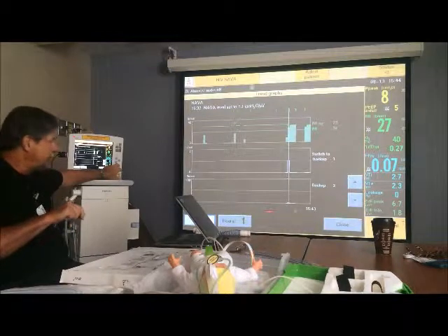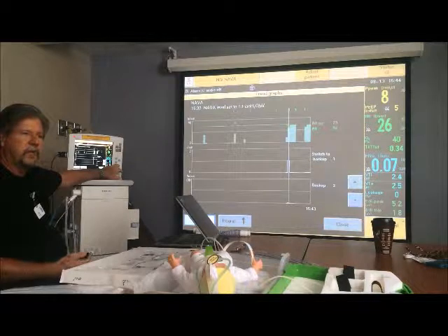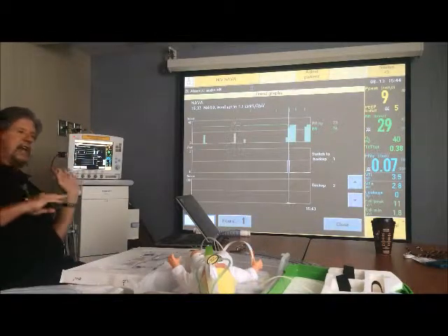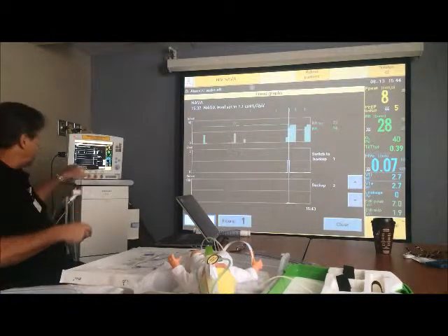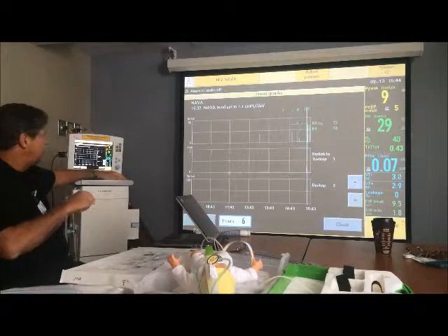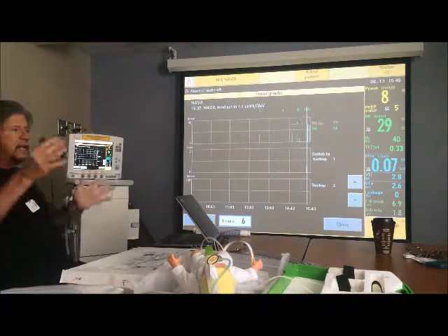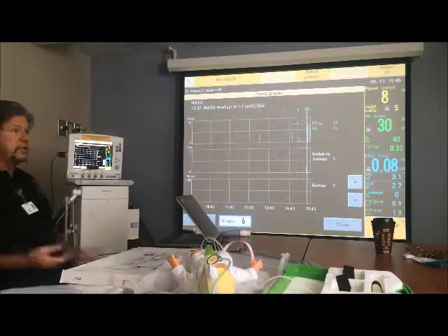But when he did switch, it was only long enough to get a couple of breaths, and he switched right back to NAVA, spontaneous. So then the next day you can come in and go, well, I've been off, or I just came in, I was working yesterday, I came back in. How many apneas or switches did he have last night? You go in and you look at a 12-hour window, and you say, well, he only had 5 switches to backup all last night, but the night before he had 15 or whatever, so you can kind of get a gauge on whether he's maturing in terms of his number of switches to backup.